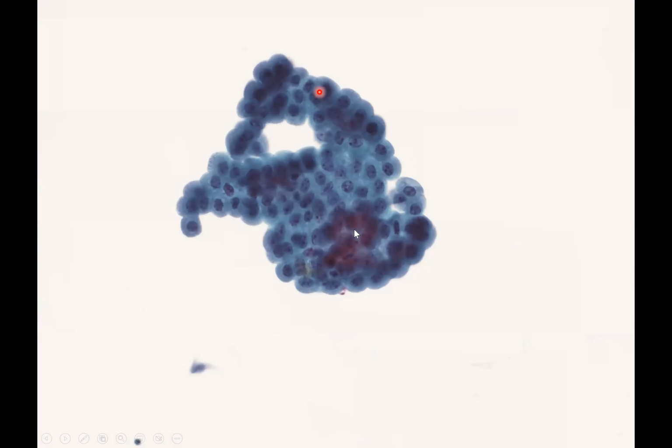And here again we have a cell group and a rather exuberant cluster, but pay attention to the nuclei. The nuclear to cytoplasmic ratio is less than 0.5, and the cells have regular polarity, round nuclei with fairly even chromatin. In this case, the patient had chronic inflammation on biopsy.